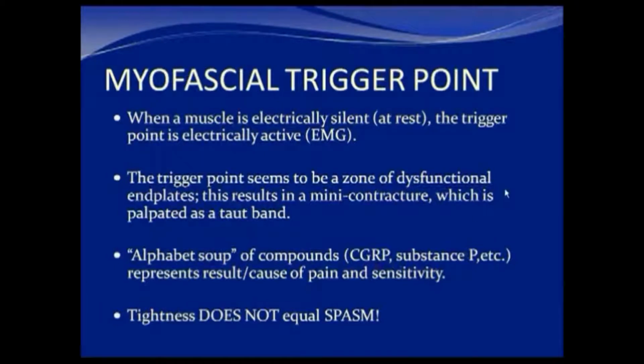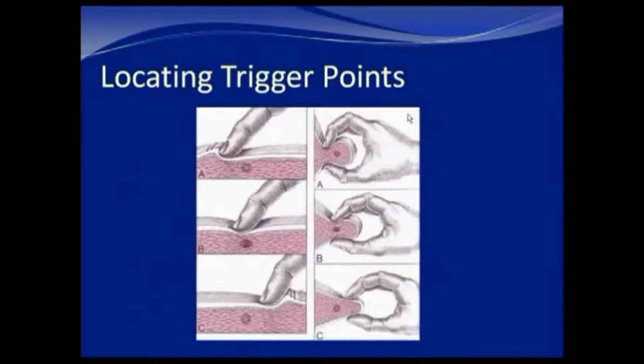What the muscles will be like when the trigger points are active. Locating a trigger point either by standard palpation, using your index finger over a trigger point that will then twitch, and you will see this twitch response with proper palpation, and you can inactivate this with any of the means which are used, but clearly the laser is the quickest and easiest way to do so.